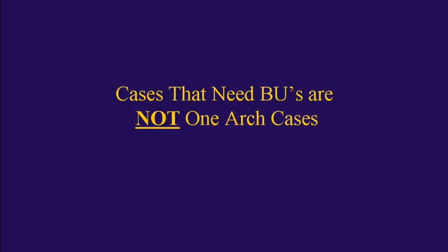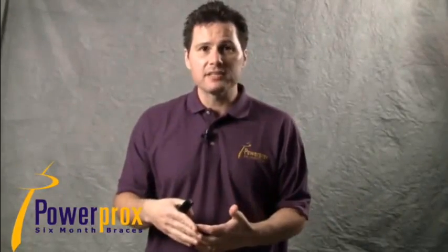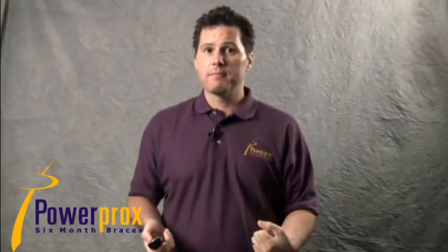First off, any case that needs buildups is not a one arch case. The reason you need buildups is because the opposing arch is causing an interference or a trap. For example, if you have a lower anterior crowded case and you put on some buildups and move those lower anteriors forward, when you take the buildups off, you're going to have a massive incisal interference. Okay, that can mess up the posterior occlusion, and it's going to cause that case to relapse as well. So a one arch case that needs buildups ain't happening. Okay, if it needs buildups, it is a two arch case.